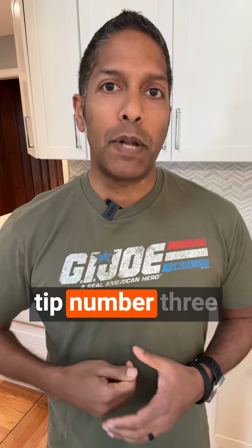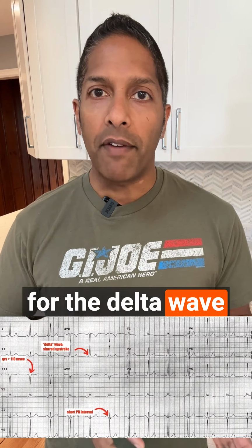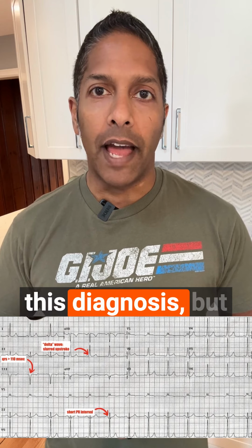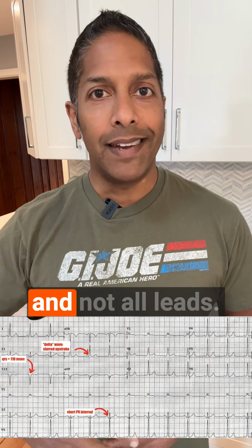And then finally, tip number three was about WPW. We know that we should be looking for the delta wave and the short PR interval to make this diagnosis, but that delta wave can be present in some leads and not all leads.